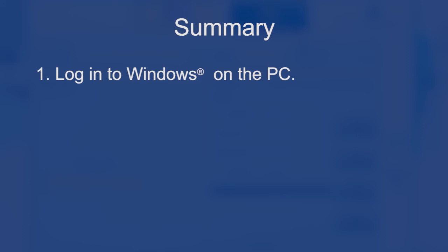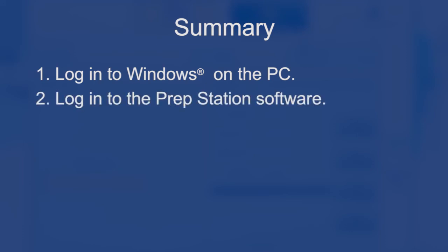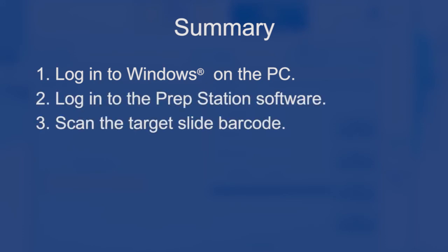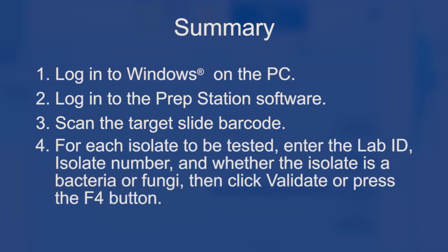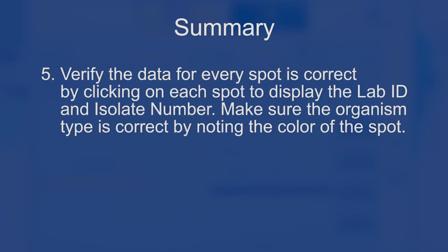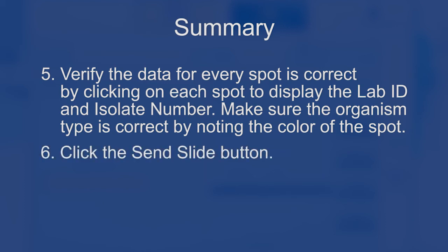Summary: Log in to Windows on the PC. Log in to the PrepStation software. Scan the target slide barcode. For each isolate to be tested, enter the lab ID, isolate number, and whether the isolate is bacteria or fungi, then click Validate or press F4. Verify the data for every spot is correct by clicking on each spot to display the lab ID and isolate number. Make sure the organism type is correct by noting the color of the spot. Click the Send Slide button.